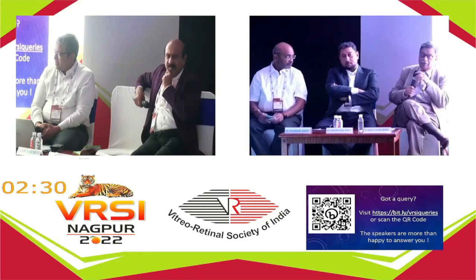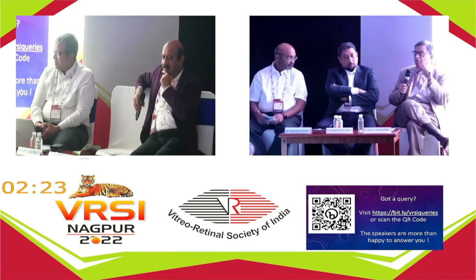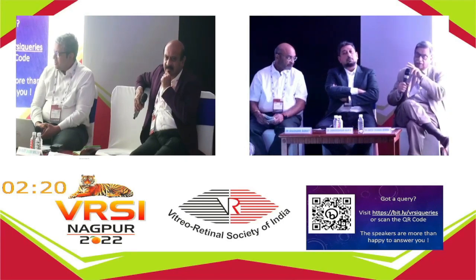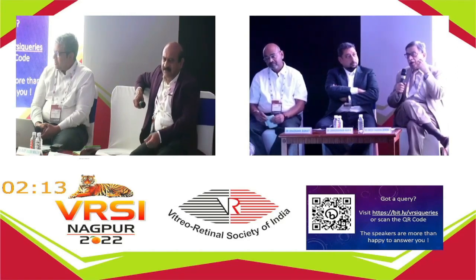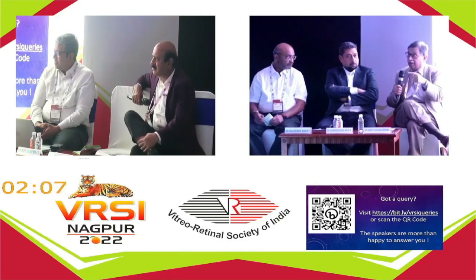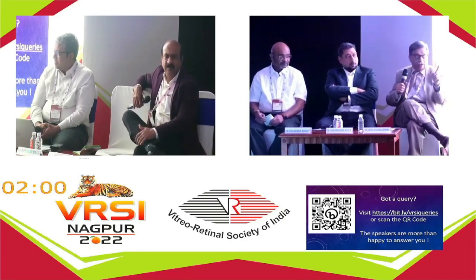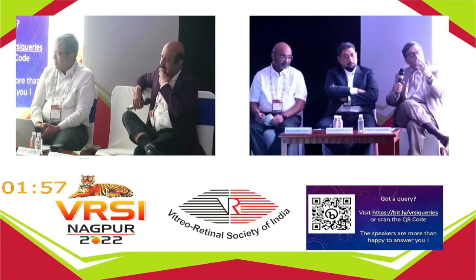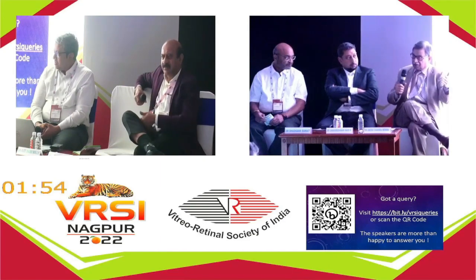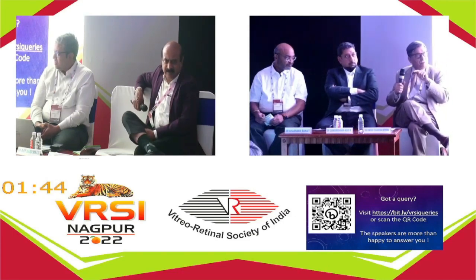In this state, the main issue is, you're asking, would my patients be more unsafe without it? The fact is that with any machine, the man behind the machine decides how unsafe you will be. You can adjust every parameter, including shaving. I have done the most complex surgeries even with a basic machine. So it's not that you can't do that, but you have to change the paradigm of management. With the correct paradigm, you'll be able to do it. For example, you have pressure adjusted infusion, so you know you can keep a pressure of 20. If you don't have that, you can bring the bottle down to the level that gives you the same pressure.